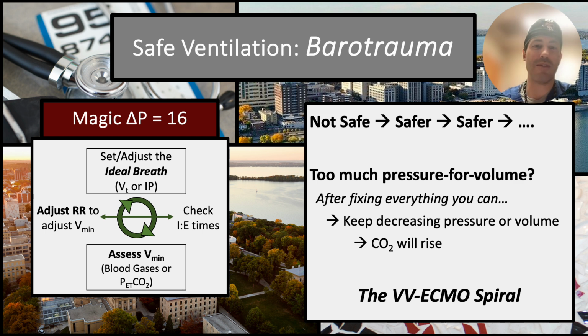I keep getting safer, and eventually you'll have a respiratory acidosis that prompts you to go down a VV ECMO pathway. And this is a common path towards ECMO in an ARDS patient.